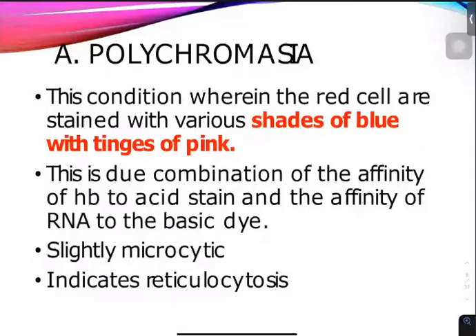Our normal cell size is 6 to 8 micrometer, so microcytic is less than 6 micrometer.